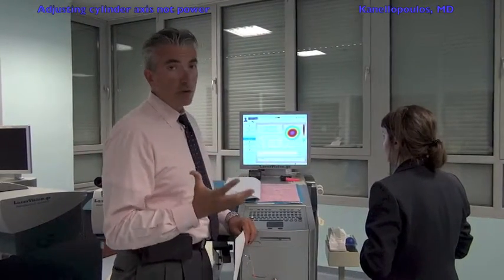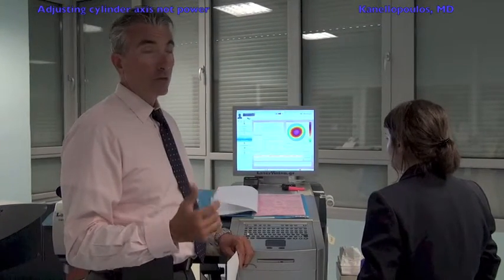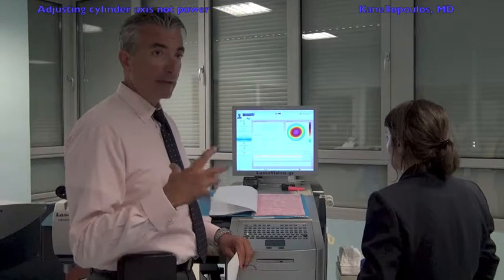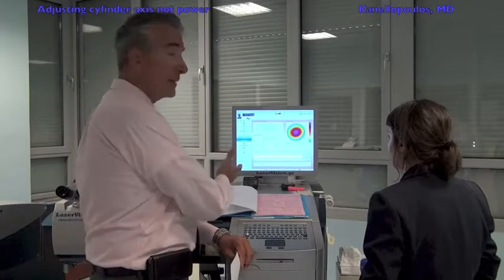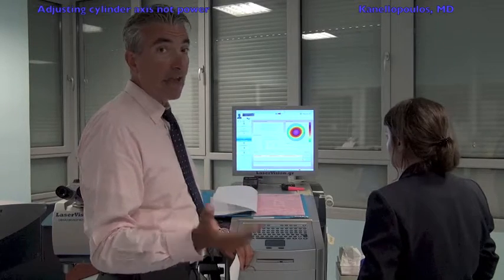Throughout the world, most of our laser corrections are based on the clinical refraction, so either the dry or the cycloplegic refraction, and we base these measurements and we place them into our lasers in regard to sphere, myopia, cylinder, and its axis.